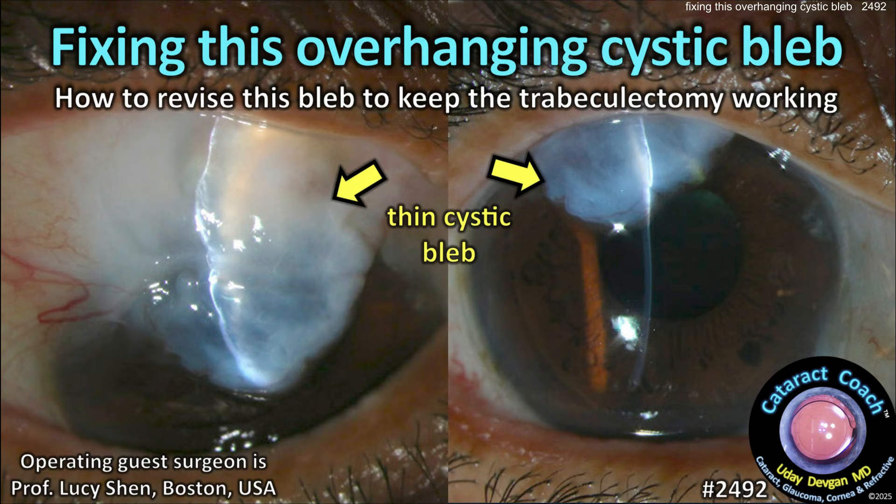CataractCoach.com: fixing this overhanging cystic bleb — how to revise the bleb and keep the trabeculectomy working, with Dr. Lucy Shen.